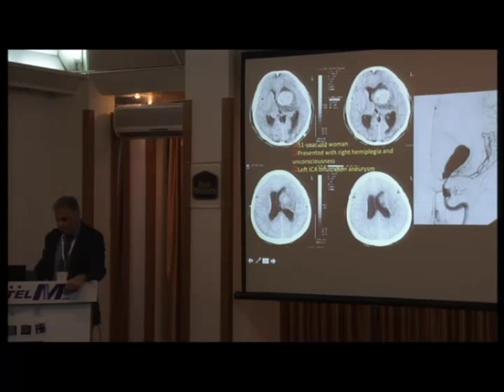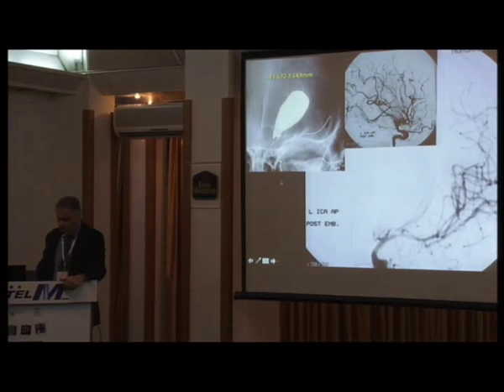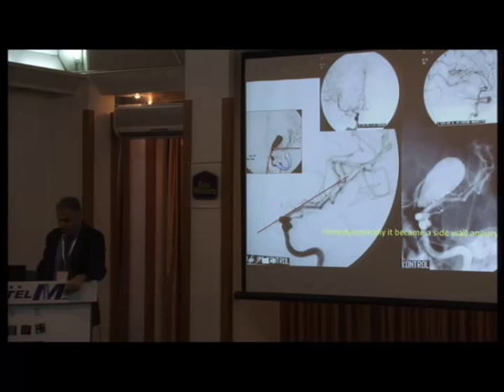In those years, they realized the hemodynamic importance in certain aneurysms. Like this, again, non-ruptured, but with mass effect from a thrombosed aneurysm, and a tip aneurysm, comatose. And what we did, again, the coronary stent, and this is Onyx. In those years, we were using Onyx. And to prevent occlusion of the perforating arteries, we stopped there. But look at what happened. After the stent, you changed the angle of the siphon tip. And this aneurysm is no longer a bifurcation aneurysm.